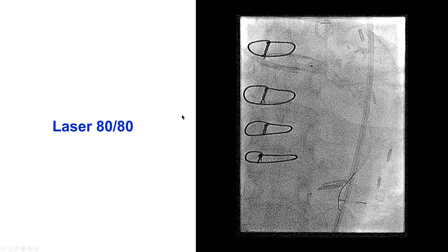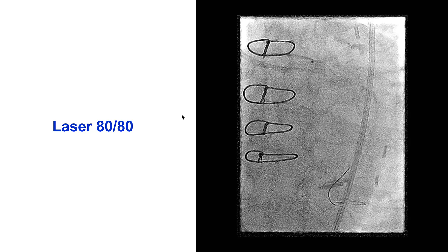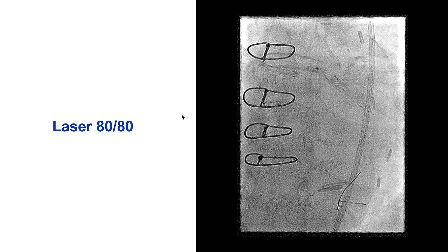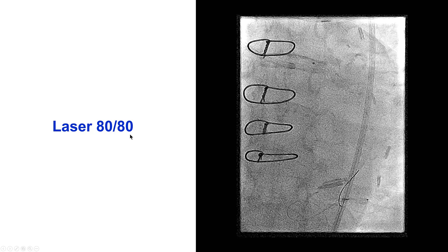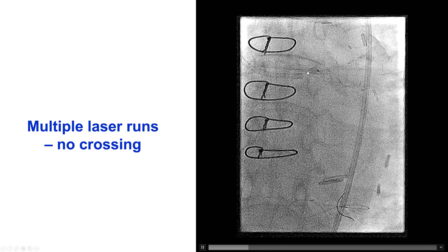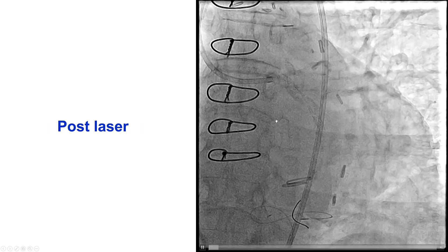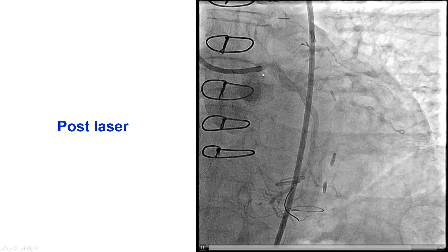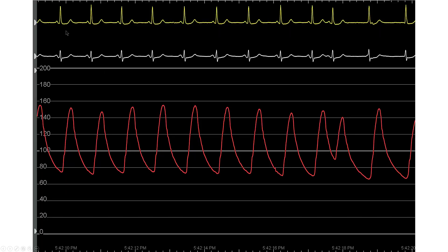The Sapphire balloon would not go. We tried a guide extension that did not work, and also another microcatheter — Turnpike LP as well as a Fine Cross. Nothing would cross. So eventually we decided to go with a laser that can go over any guide wire. This is the 0.9 mm coronary laser activated at 80 energy and 80 fluency. The laser did not cross the left main; however, even though it does not cross, it may modify enough of the plaque to allow subsequent crossing with the balloon. The flow improved after laser into the left main, and that helped with improvement of the ST-segment depression on the EKG.